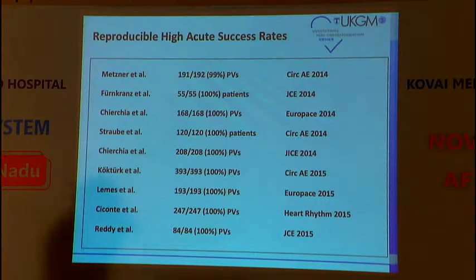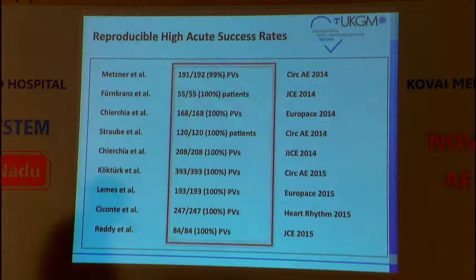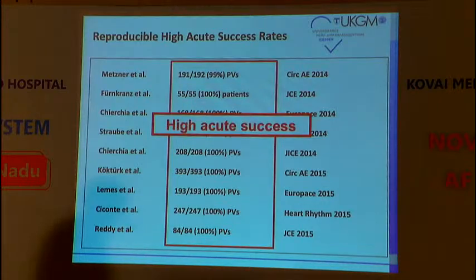So it is very, very rare that you do not isolate the 4 PVs, or that you have to stop a procedure, or that you won't succeed. So acute success rates are very, very high.